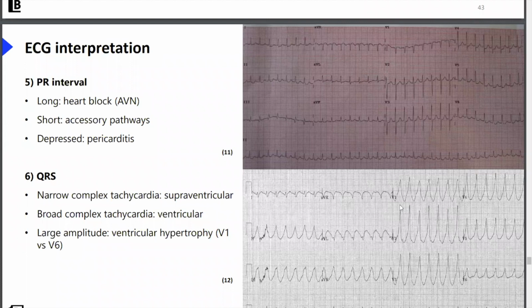VT, dangerous. VT is bad. Patients in VT, they could die imminently or cardiac arrest imminently. So if as an F1 or even as a medical student, you see a patient with this ECG, you call for help straight away, okay? Because this is potentially fatal.